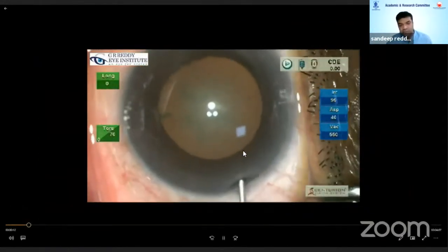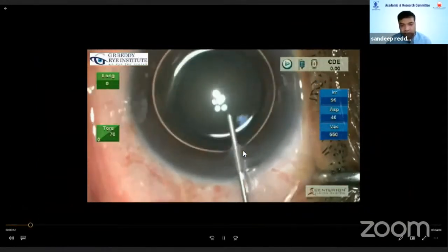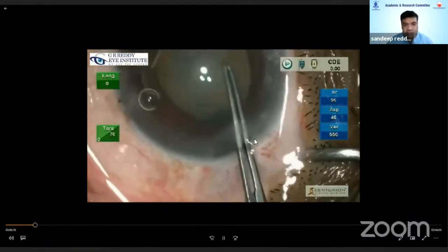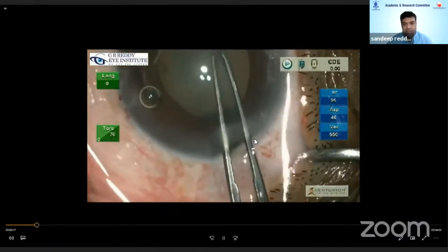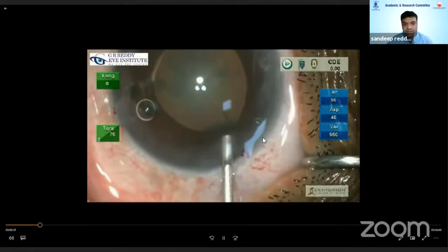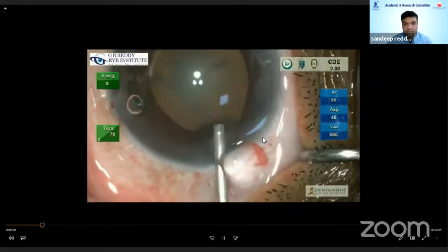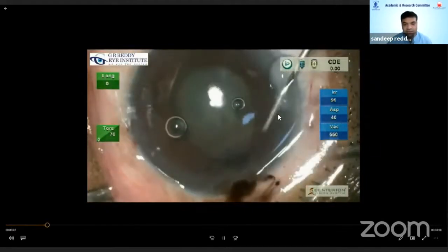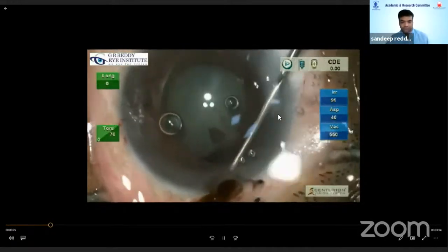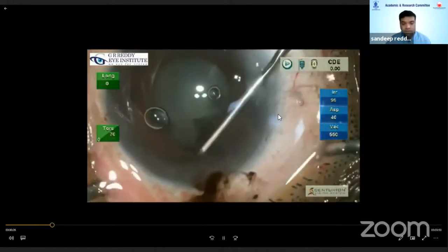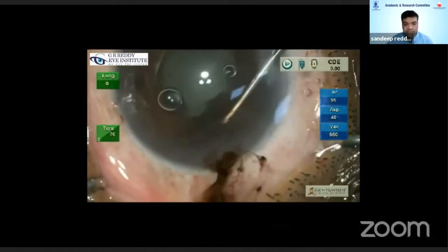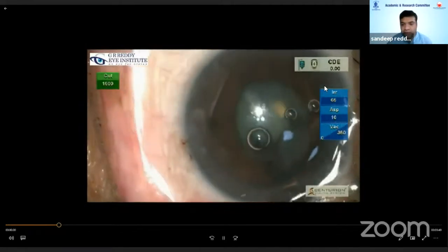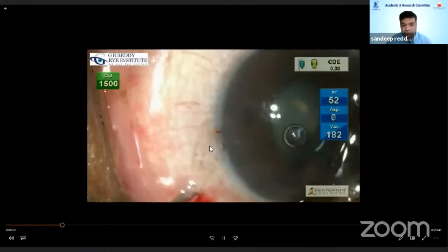This is a case of a very short eye where the IOL power was around 28 diopters. I started doing the rhexis, and when I was putting in viscoelastic, all of a sudden the IOP was very hard and the iris started prolapsing out. I tried to maneuver and put the iris back inside, but could not.